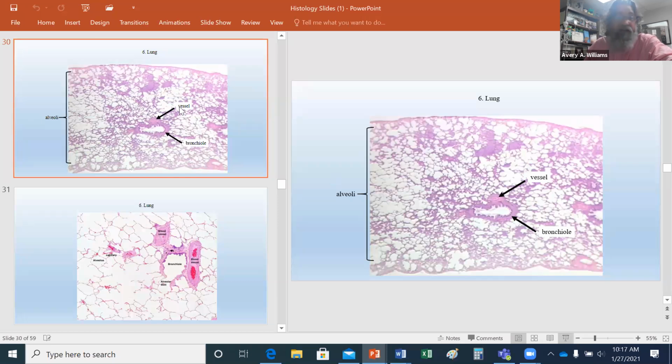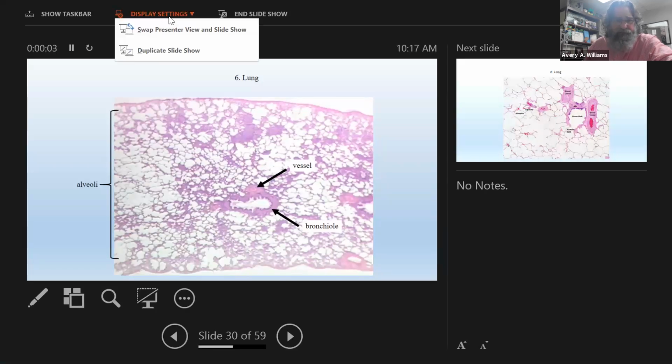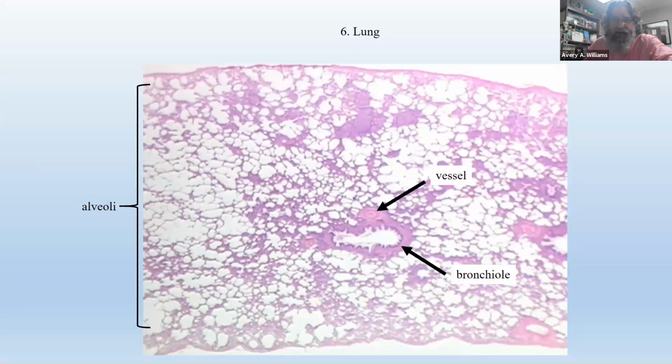You like the lung? I like the lung. Because, I don't know, it's just got some really great tissues in it. Nothing looks quite like the lung. There's a section of the lung magnified about 40, 50 times, something like that. And your field of view, when you're looking, you just see this stuff everywhere. Nothing else looks quite like this.